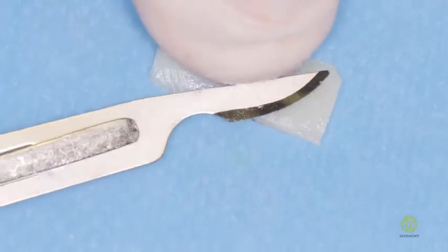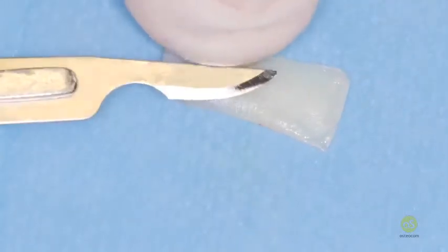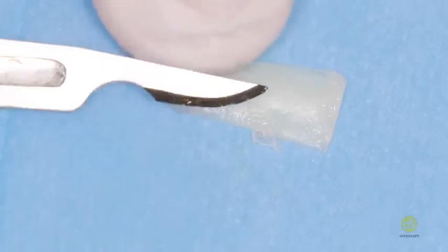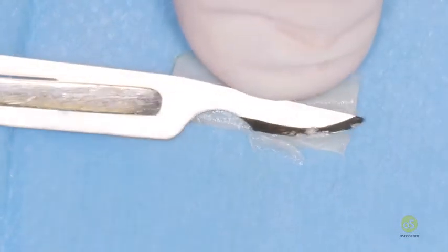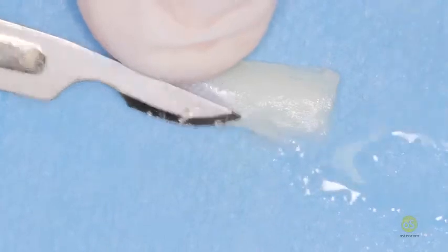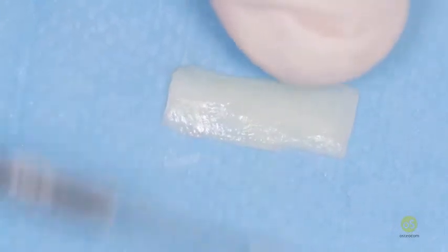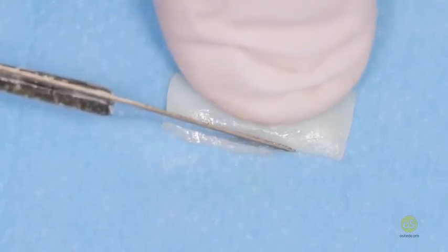Don't forget that in the most corner area you bevel your incision, and so there is an area with epithelium and no connective tissue, and this is the area that I'm really facing just now. So first of all, I want to complete the horizontal desepithelialization, so to leave this area to be desepithelialized vertically with the vertical desepithelialization.